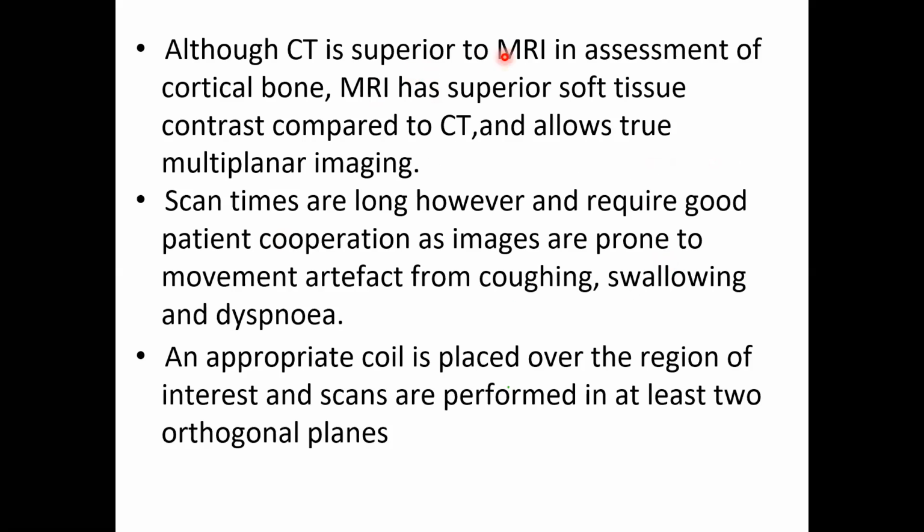Although CT is superior to MRI in assessment of cortical bone, MRI has superior soft tissue contrast compared to CT and allows true multiplanar imaging. You should keep in mind that MRI is for soft tissue. A very important point I'm trying to stress over here.